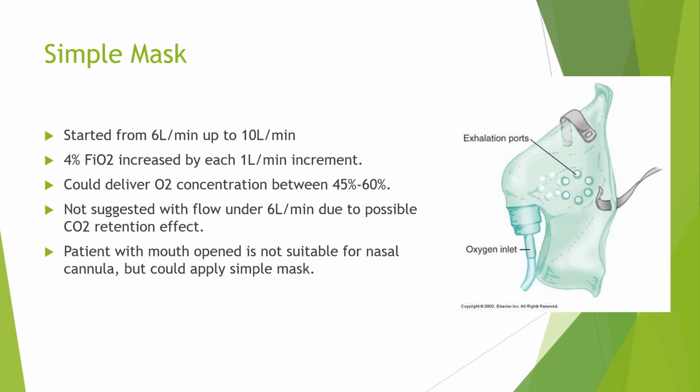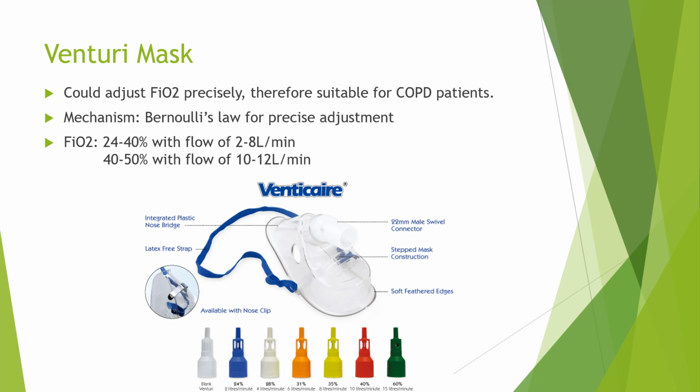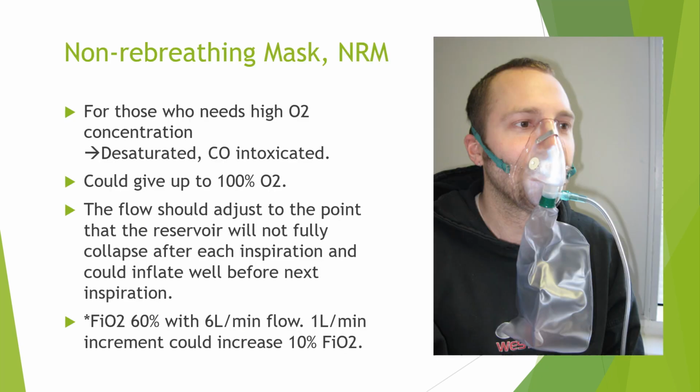Okay, and here comes the Venturi mask. The Venturi mask uses Bernoulli's law for precise inhaled FiO2 adjustment, but usually it costs more, and it is less used.